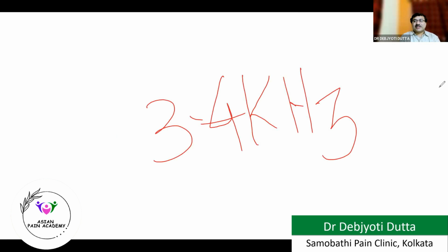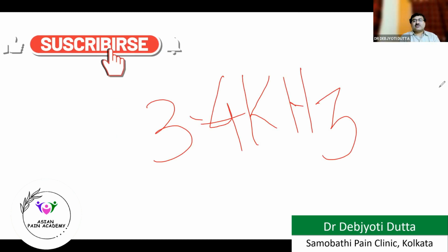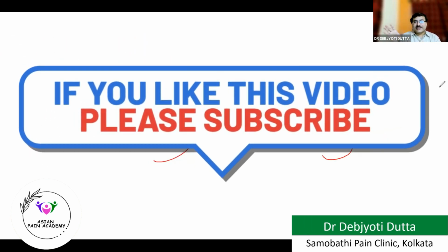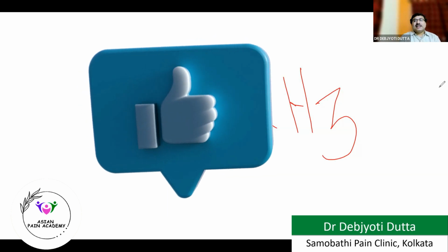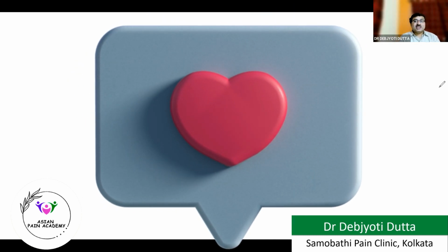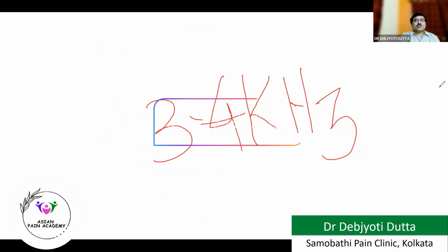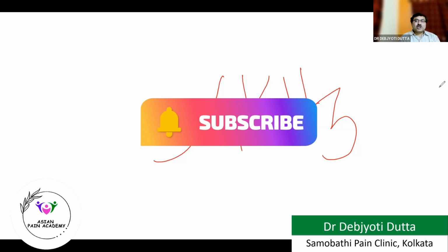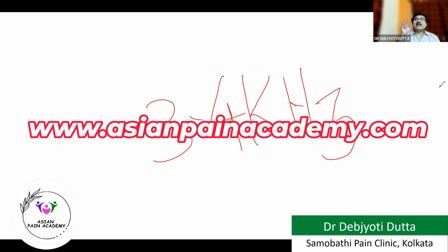Normal home electricity in India is 220 volt, which is the potential difference between two ends of the conductor, and the frequency of the current which is flowing, that is alternating current, is between 50 to 60 hertz. But in radio frequency, a much higher frequency current is used. The advantage is that at that higher frequency, it cannot stimulate our nerve tissues, neither the conductive tissues of the heart, but it retains the heat effect of the current.